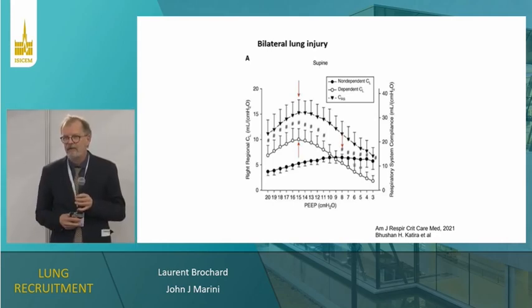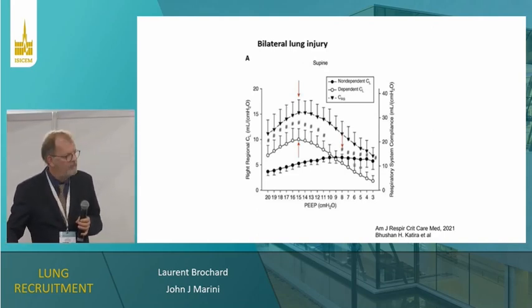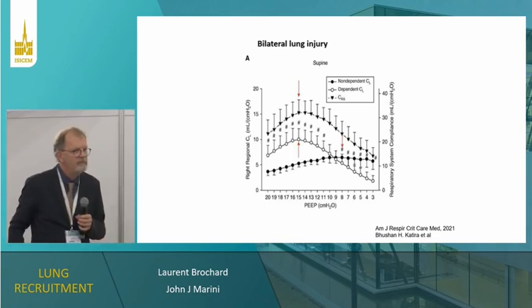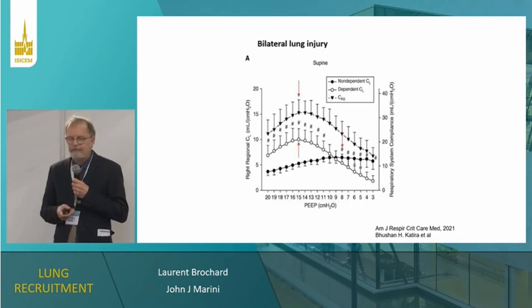rtmaven.com, so you will see the video. Okay? But just remember, it's always a trade-off, okay? And so a higher recruitable index tells you it's more favorable, better than worse.